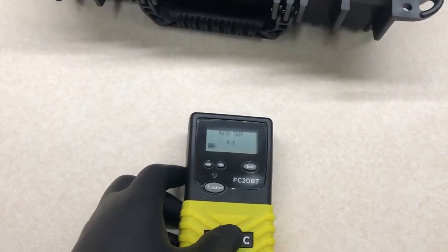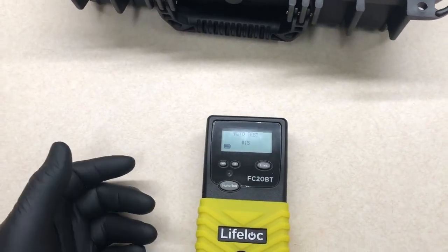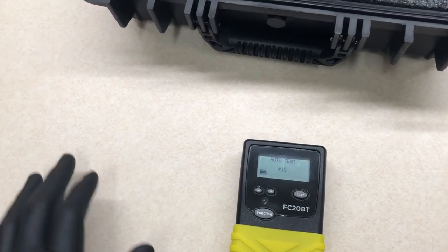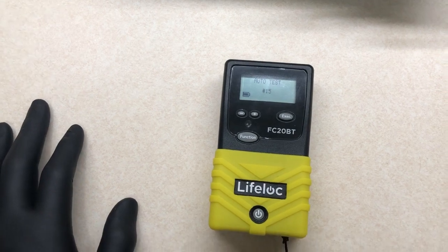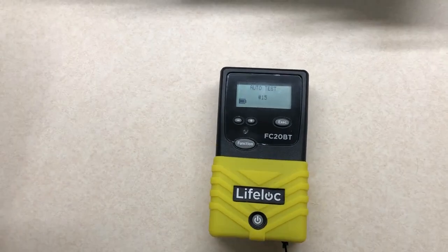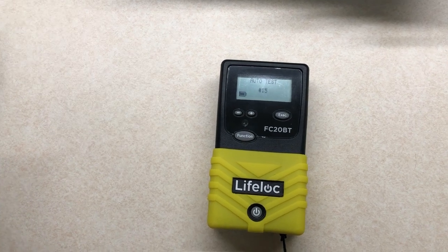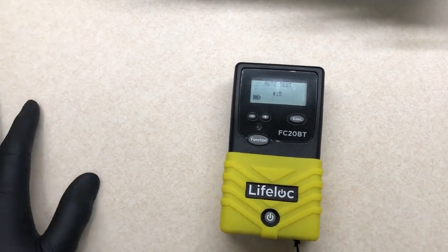Now we're going to go over the auto test function. The auto test function is for a patient normally that would be compliant, that isn't short of breath, or the patients that you would want to get to give you a sufficient amount of breath through the straw.